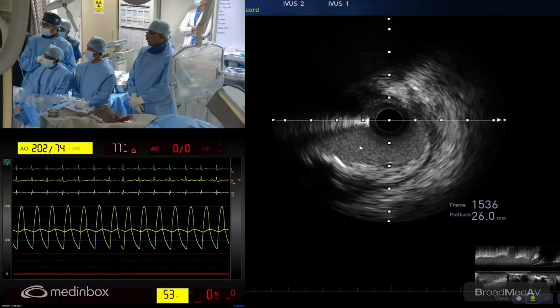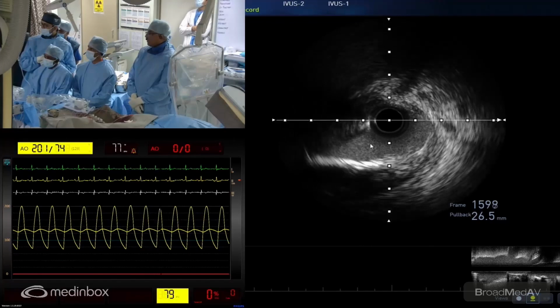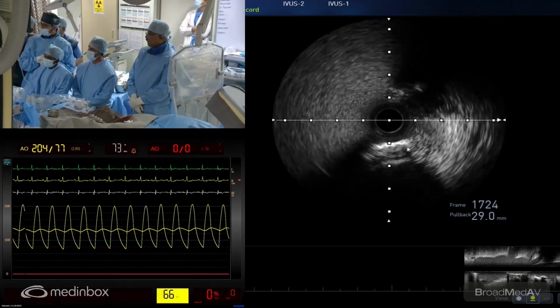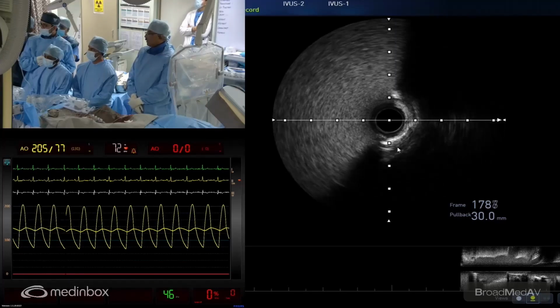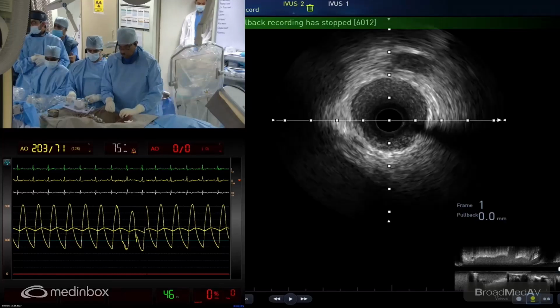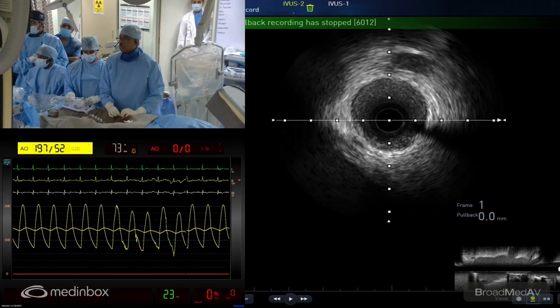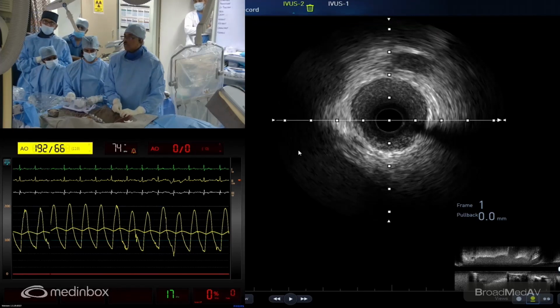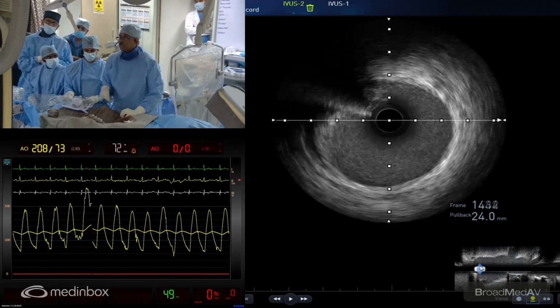Still there is no flap, and here comes the lesion. It's reasonably the same, and tight ostial. No obvious cuts also noted. As we expect, we may not see any cuts here. It's basically spongified. The calcium cuts are better seen with the OCT catheter.